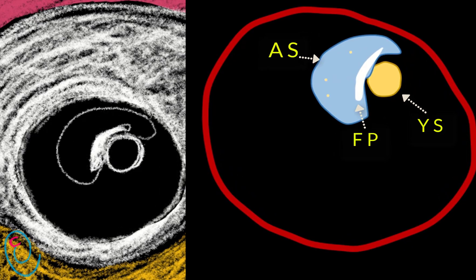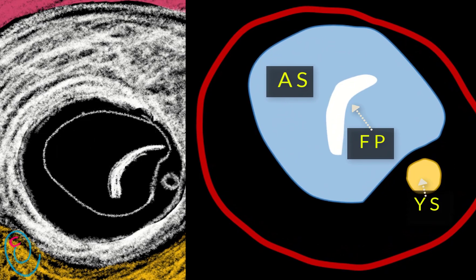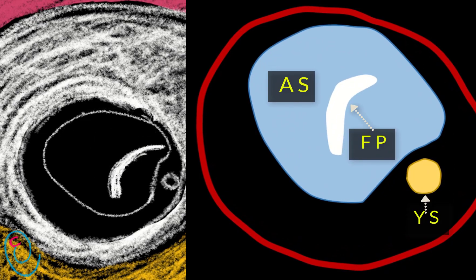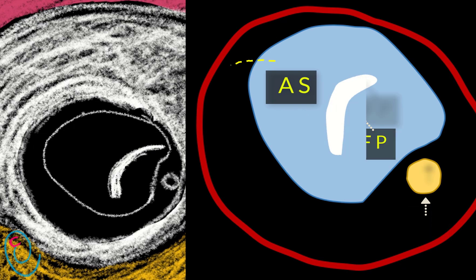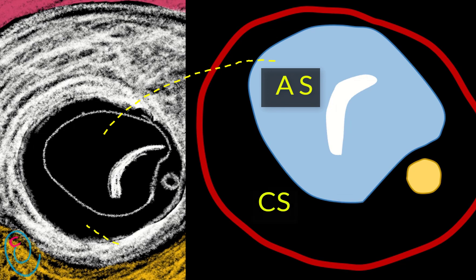But after 10-week gestation, fetal urine production will result in faster growth of the amniotic sac. Consequently, it will occupy an increasing area inside the gestational sac, and two cavities will be visualized inside the gestational sac — the amniotic cavity and the chorionic cavity.